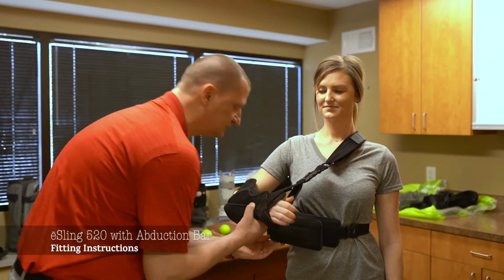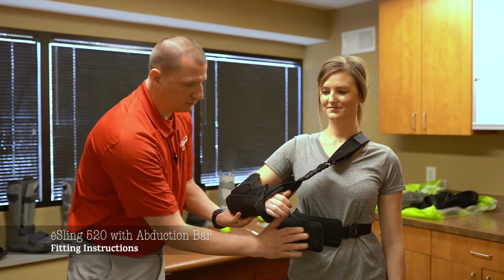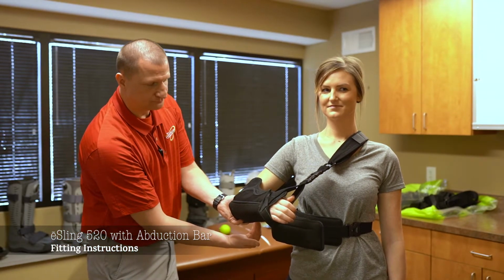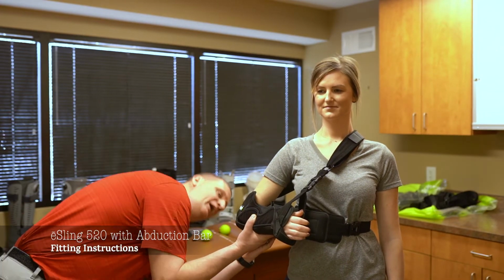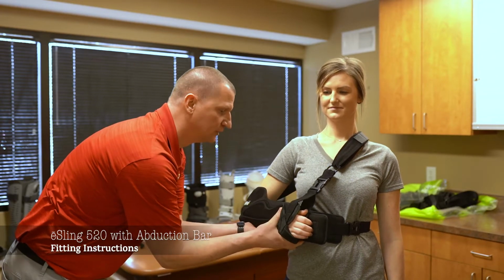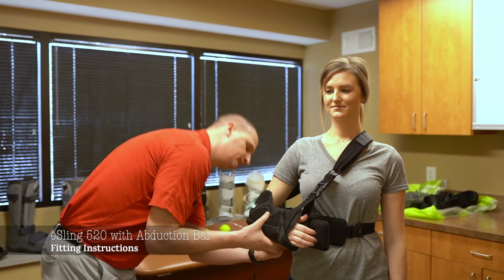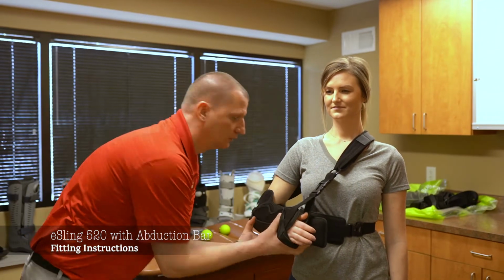Once this is set, okay, then we need to Velcro it to the arm positioning rail. Okay? It is important to have the elbow off of the rail. So whenever you position, the back of that elbow should be about 1 inch to 2 inches off the back. Okay, we do not want to harness that to the arm positioning rail. Okay? Alright.